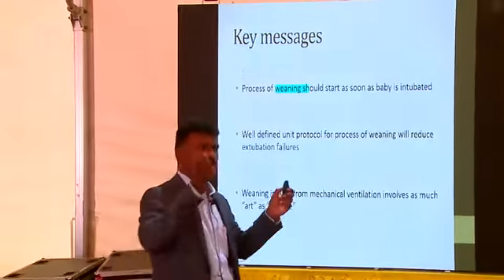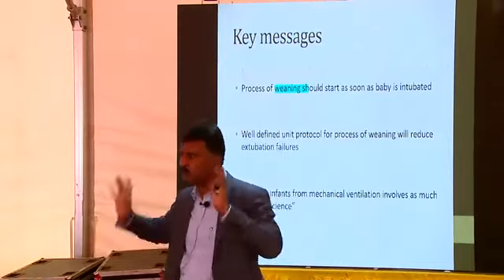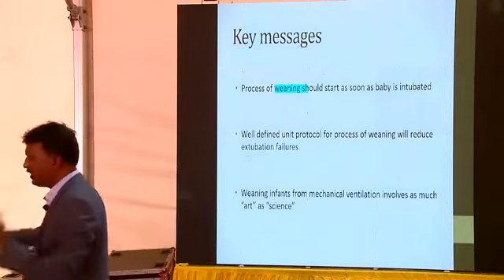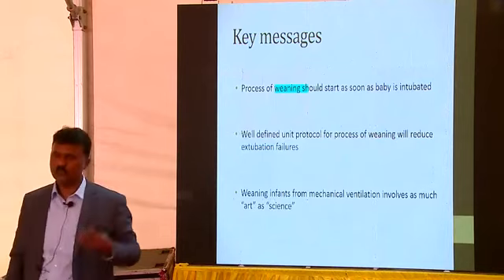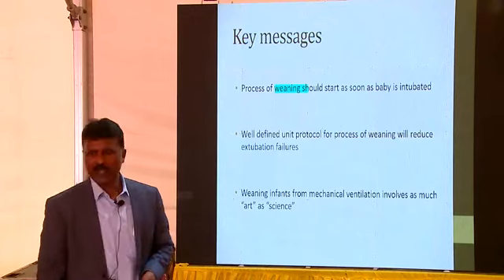You understand the limitation of each, then you know how to play around with any mode. Nobody has said that one mode is better than another. The only thing people have said is that volume guarantee is better than patient triggered ventilation because it has natural weaning, and it has definitely been shown to be evidence based. But there are problems in volume guarantee also, which I will talk about two days later.